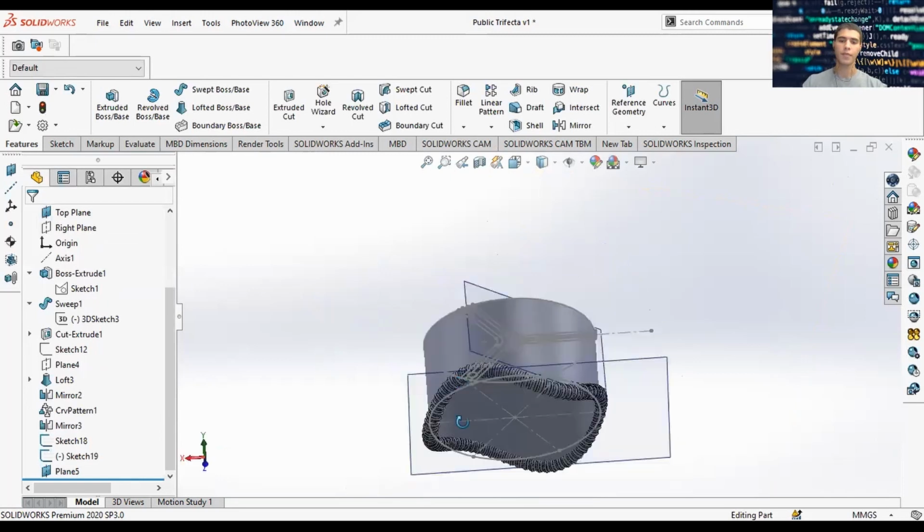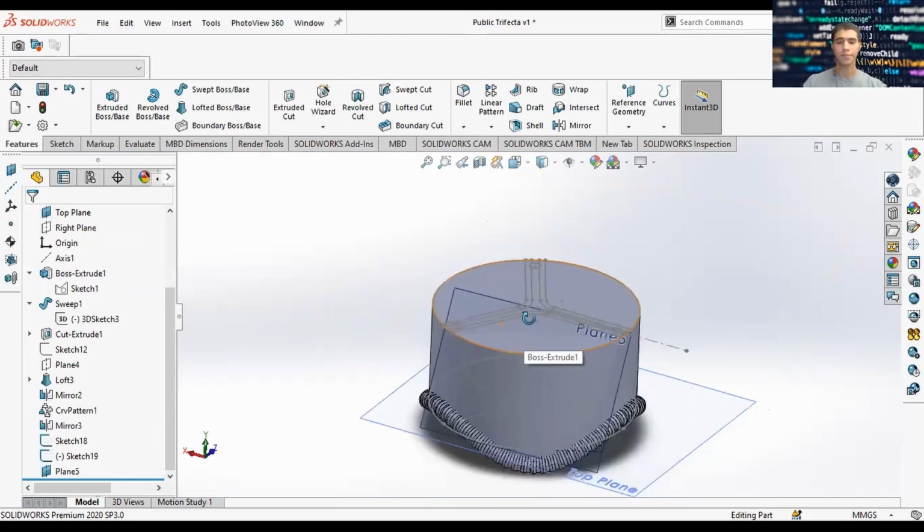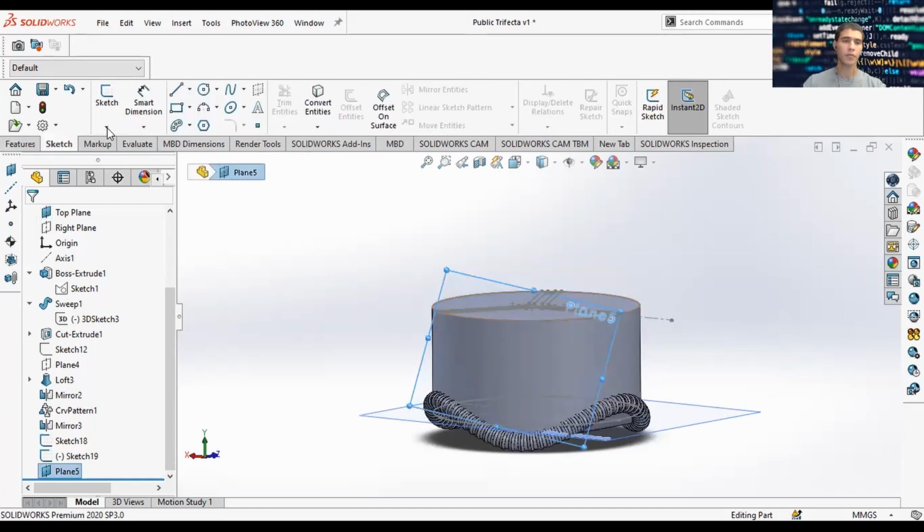All right, so we have the plane at 3 points, and now we can sketch on it. We're not just going to make a 2D sketch, we're going to make a 3D sketch, if possible. So we select our plane number 5, do a quick save. Select our plane number 5, and do a 3D sketch.